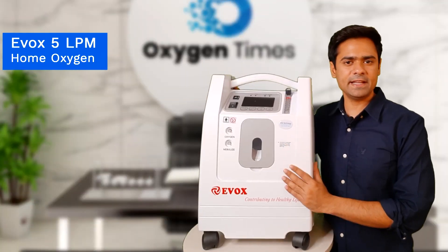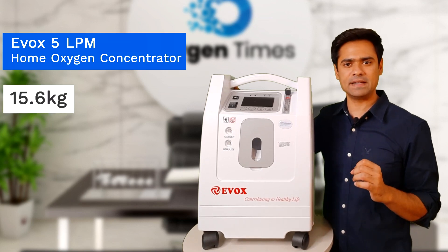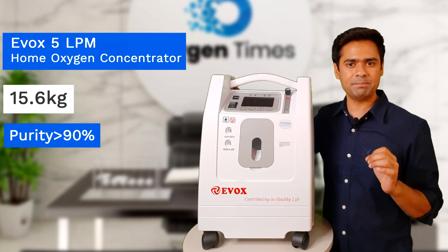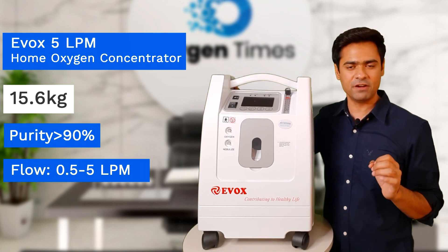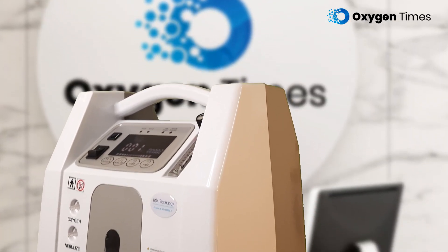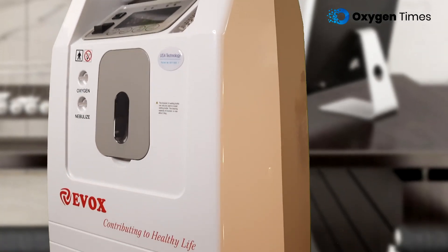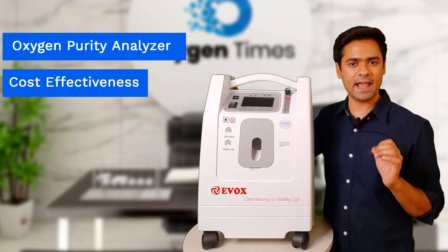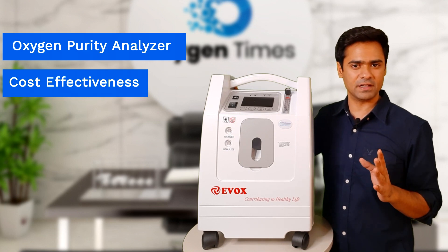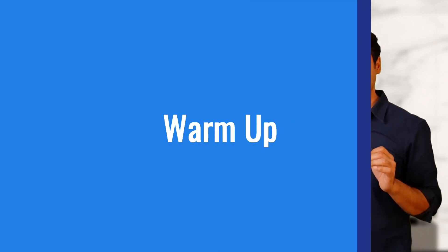This is the latest Evox 5 LPM Home Oxygen Concentrator, which comes in a weight of 15.6 kg and delivers oxygen purity above 90% at all flow rates from 0.5 to 5 liters per minute. Evox 5 LPM is a comparatively new contender in the Indian market. Its unique selling point is the presence of a built-in oxygen purity analyzer and its cost effectiveness. The machine is loaded with features that will surely amaze Indian customers.